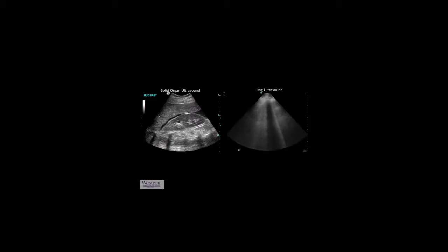The biggest rub with lung ultrasound for most people is the fact that it's non-anatomic. When you look at the rest of point-of-care ultrasound, you look at the anatomic images like this FAST exam with fluid around the kidney, the liver. You can show that to patients' families, to the janitors, to the nurses, to the hospital CEO, and everyone understands intuitively what they're looking at or can get behind it a little bit. But when you show somebody this and try and tell them that it represents pulmonary edema or ARDS, it's a bit more of a leap of faith because it's artifact driven.